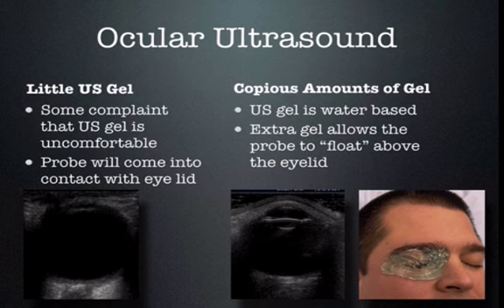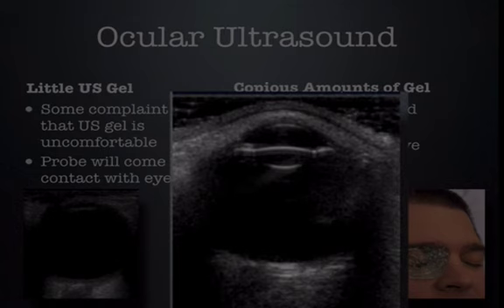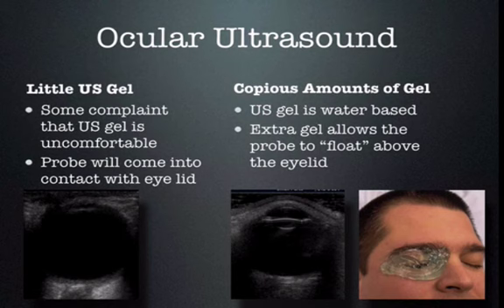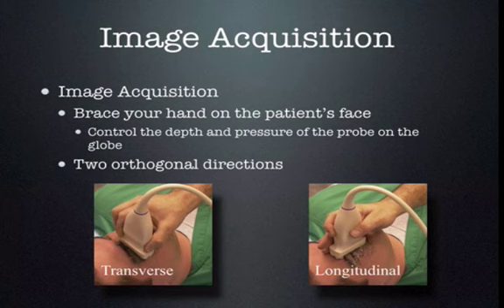The other advantage of using a lot of gel is that you can see the near field much better. Probes have a near field and a far field, and having that little bit of gel increases the ability to see in the near field. On the image with more gel, you can see the eyelid and the tarsal plate — the hypoechoic stripe running in the eyelid — very well. With very little gel, you cannot see the eyelid or the tarsal plate. If you're only interested in the retina and the posterior portions of the globe, a little gel works well. If you're interested in the anterior globe or anterior chamber, use a lot of gel.